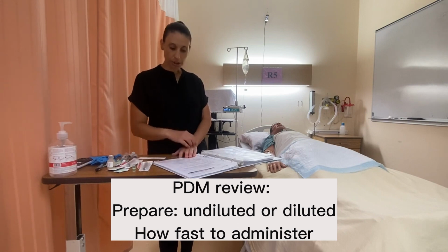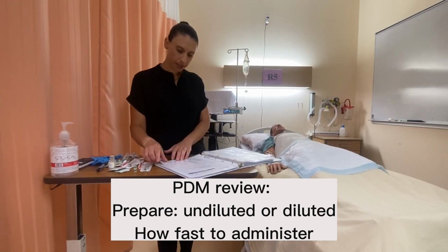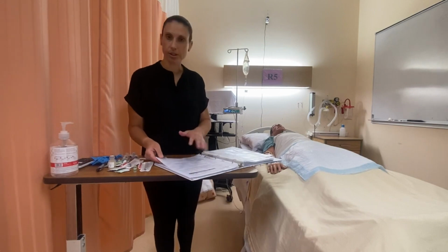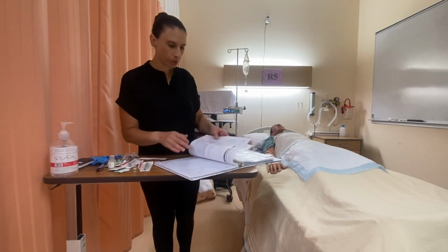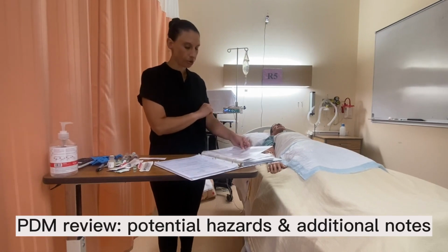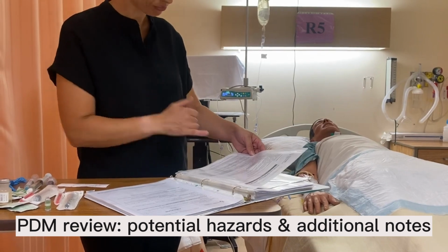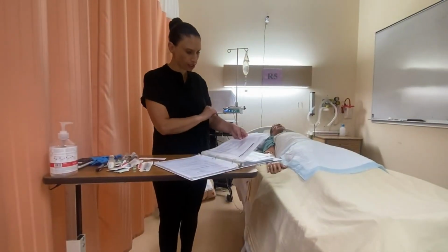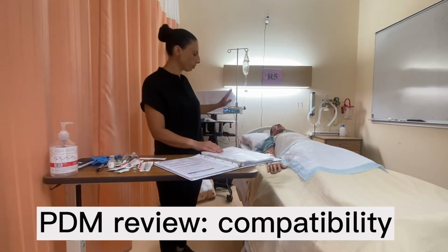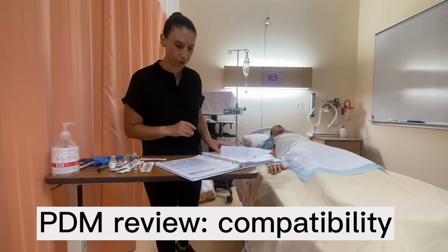And it tells us a few things about how to administer it. So it says we can administer undiluted or diluted. So it gives us two options. And it tells us what to mix it with and how fast to give it. So those are all really important things to check on our PDM. The other things we'll want to check as well, the potential hazards, so we can also educate our patient, and also so that we're aware of the hazards of the medication we're giving. We'll check the additional notes, and as well we'll also check the compatibility to make sure if there's a running IV that the medication is compatible with the running IV, the primary infusion.